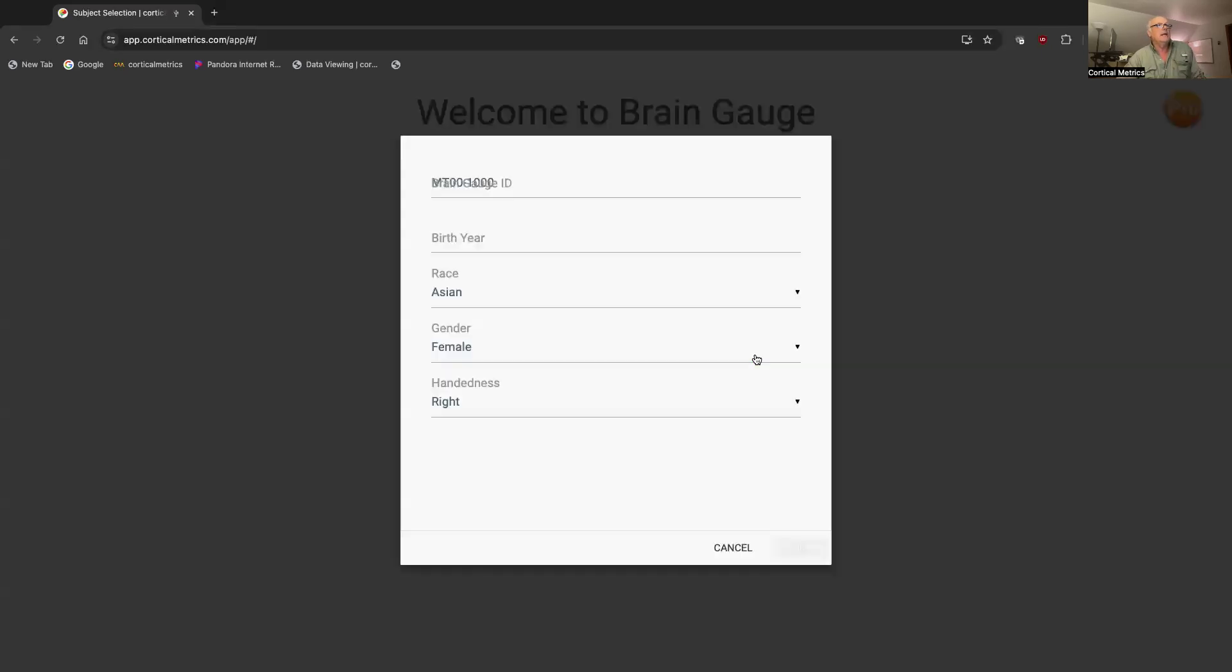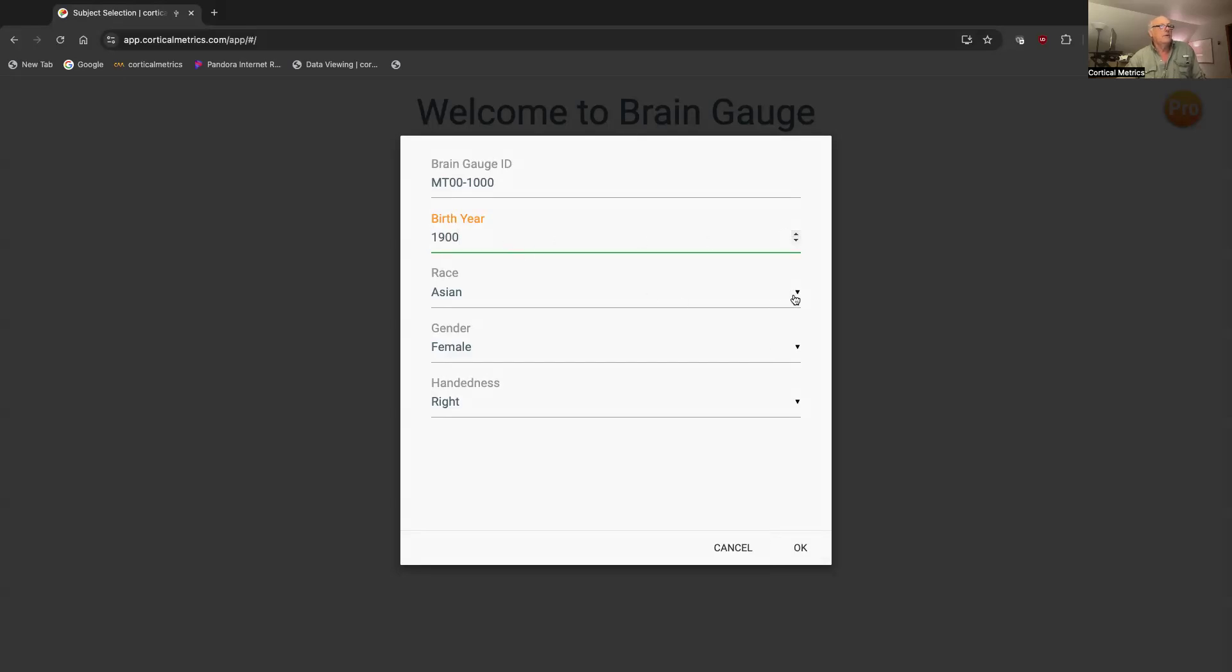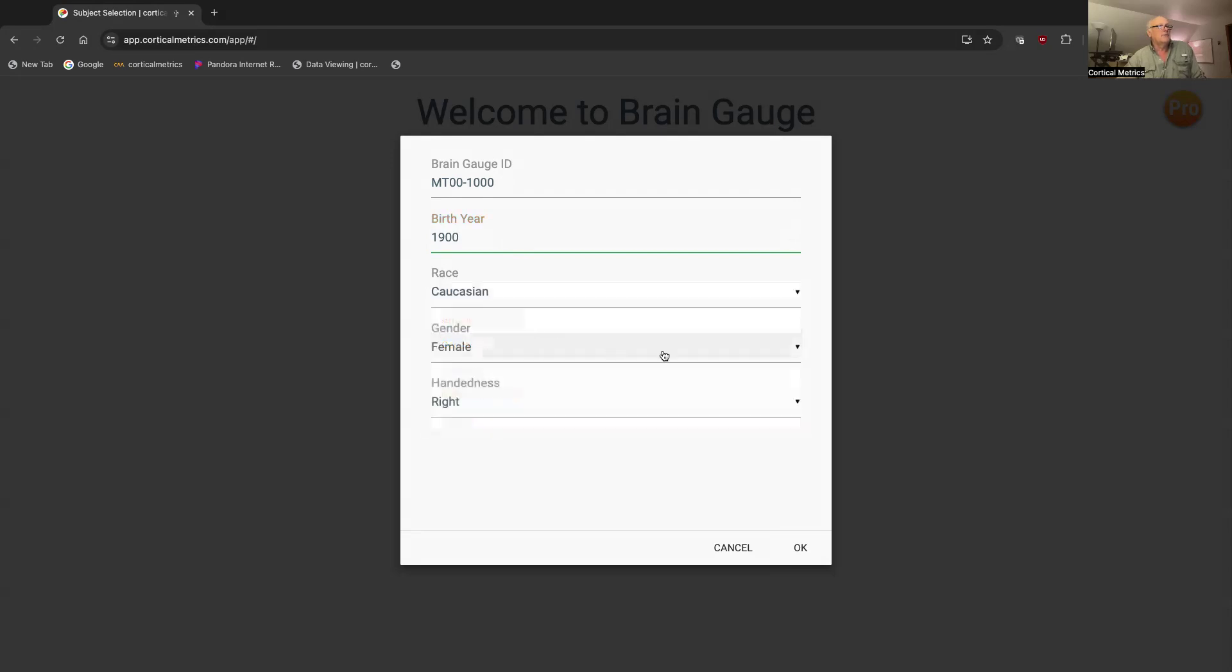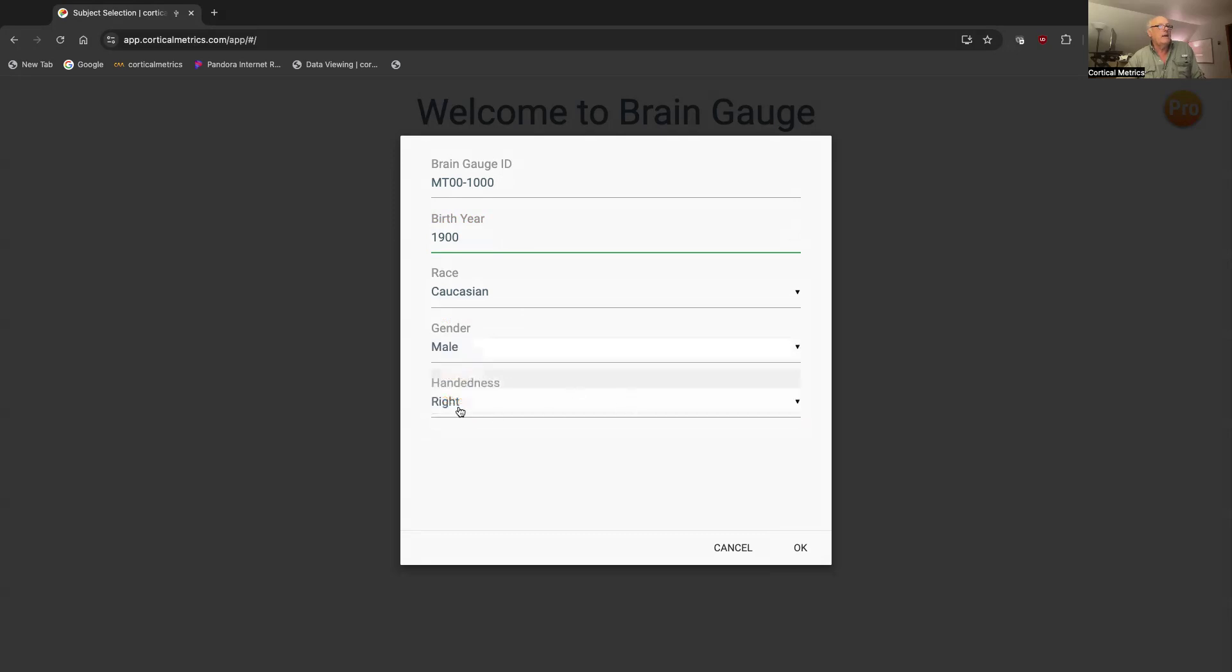So I'm going to click here. It's going to ask for birth year, and since I'm really old, I'm just going to settle for 1900. I'm going to identify myself as Caucasian. None of these things are really important - the main thing is handedness, and that really has to do with testing.